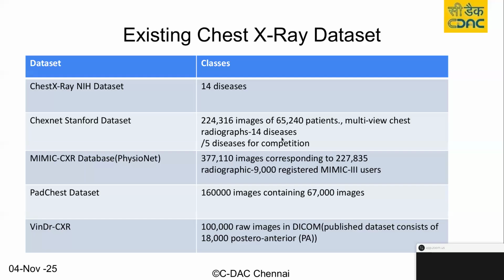With so many large numbers of images, doctors are finding it difficult to label. In fact, the NIH dataset labels themselves are extracted by using LSTM language processing models, from a website of this hospital, which is actually storing the X-ray data along with the findings marked by the doctors.